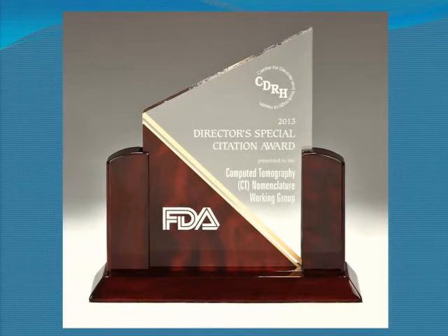And that's kind of tricky. I know the dose tracking software can often produce them, but they tend to come from these standardized patient models that don't necessarily reflect our patients. And I can't quite figure out how they handle things like organs that are fully irradiated and organs that are only partially irradiated. And so I'm not convinced that those values are terribly meaningful yet. So I think it may be a while before we jump into that fiery hoop.